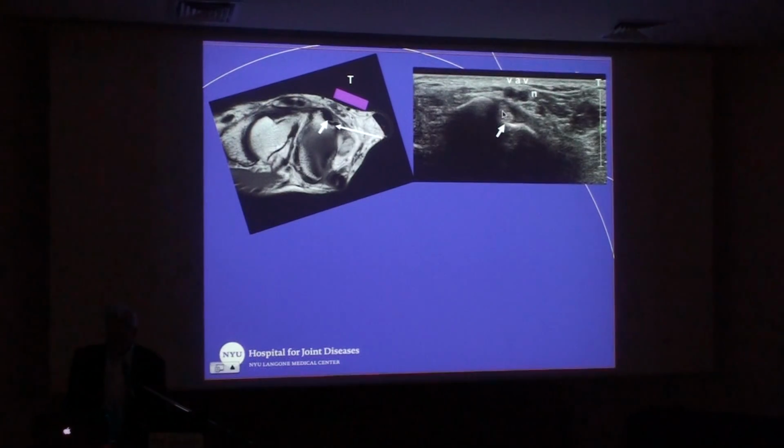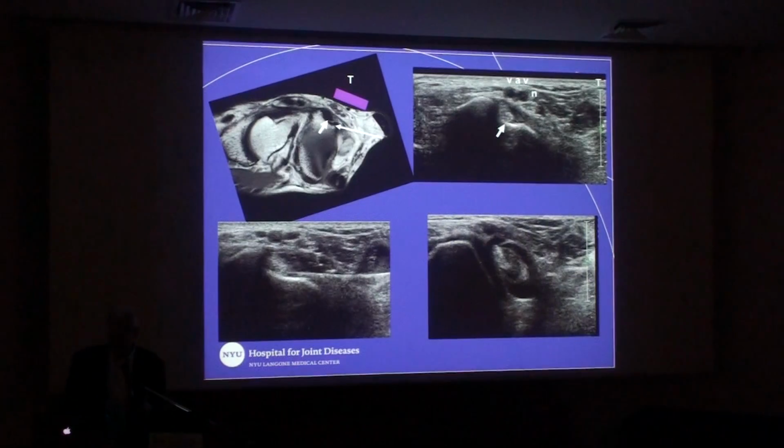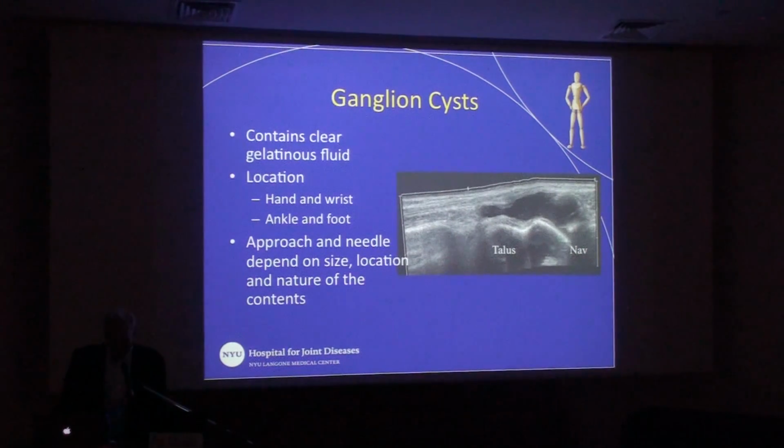So if you look over here, this is what the corresponding ultrasound image looks like. There's my needle going in lateral to the Achilles tendon, deep to the FHL, and then I'm going to inject, and I see distension of the corresponding tendon sheath. It's a very nice approach. That way you avoid the neurovascular structures, and you can do these injections fairly simply. I find it better than fluoro. I can't imagine doing that fluoroscopically.